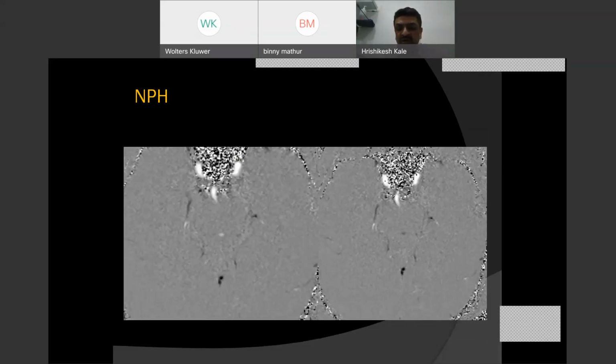One technique which is advocated, but which is controversial, is using CSF flow evaluation.